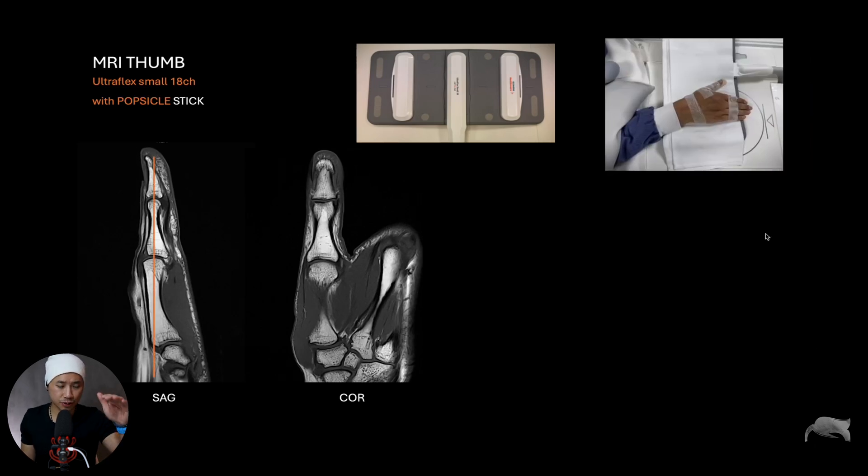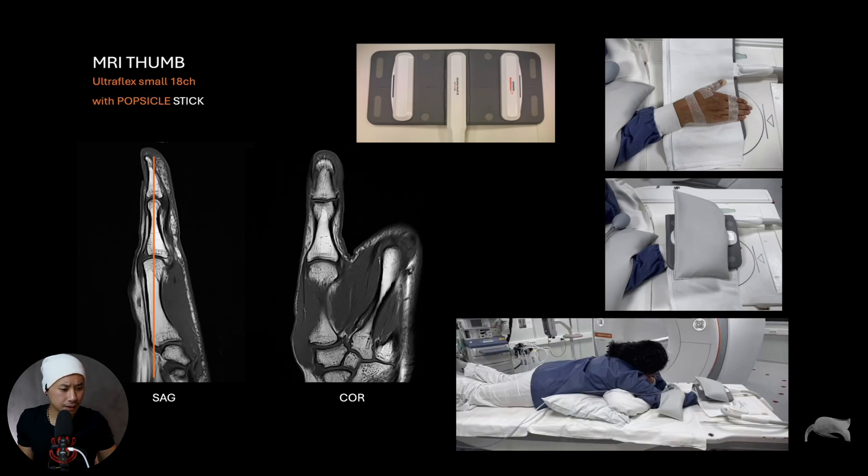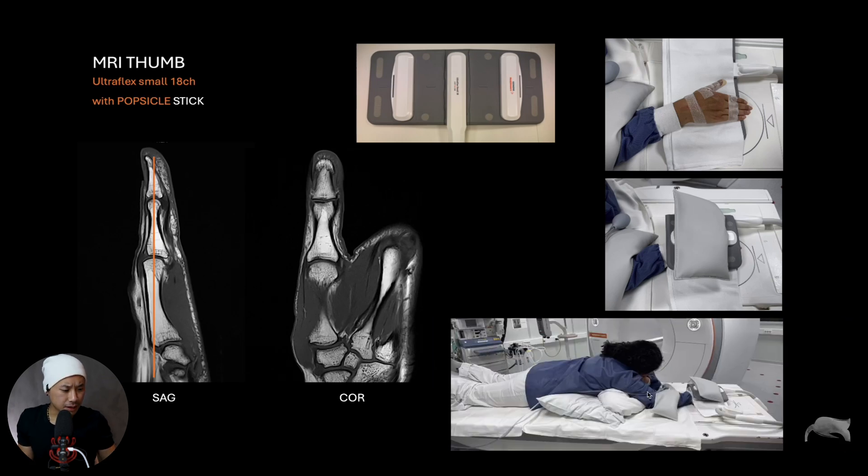You can also use the ultraflex small coil with the same approach. What we did here is a Superman positioning — we positioned the hand with the thumb extended. I did some tape of the fingers so they stick together, and then taped the popsicle stick right there. Then we put the coil over, added a sandbag to fixate it. There's also a pillow here and there, and it's important to fixate with sandbags and be careful with the cable so you won't break it.